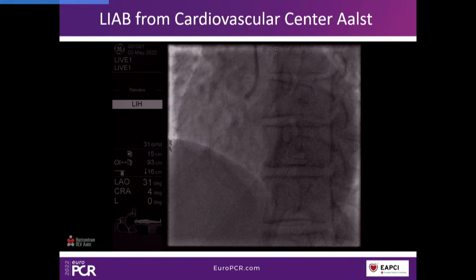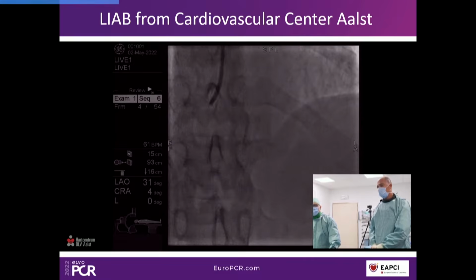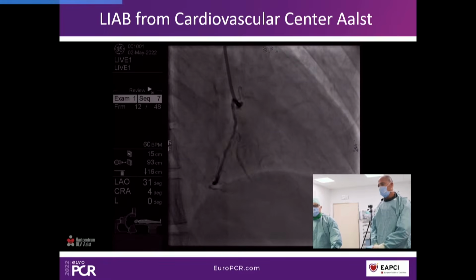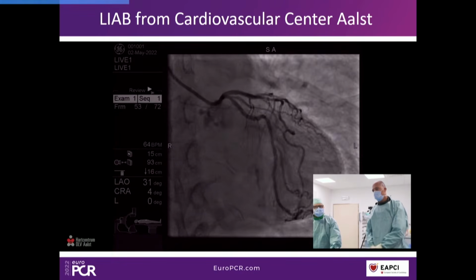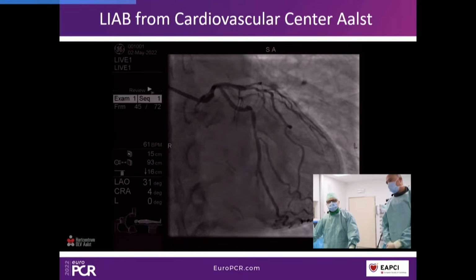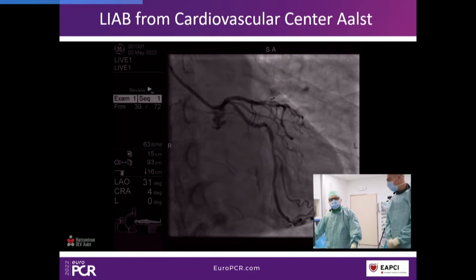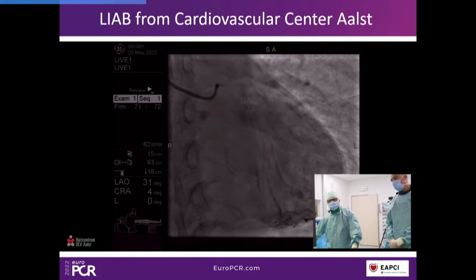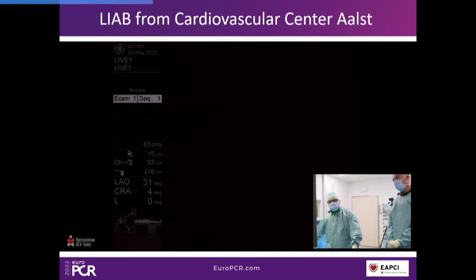While going live, we collected some baseline angiograms that we were discussing with Jeroen. Let me go all the way back to the left coronary artery first. We have already an intermediate lesion on this marginal branch, Jeroen. Indeed, it's a very focal lesion, appears to be focal, not so severe, if you ask me, but nevertheless we will interrogate and assess this one using FFR.